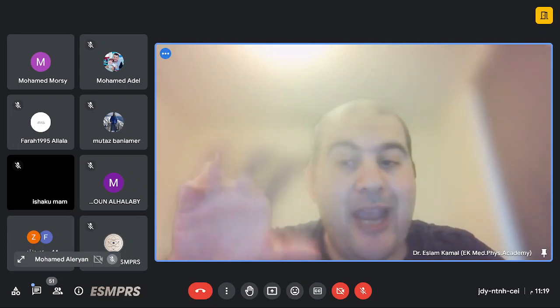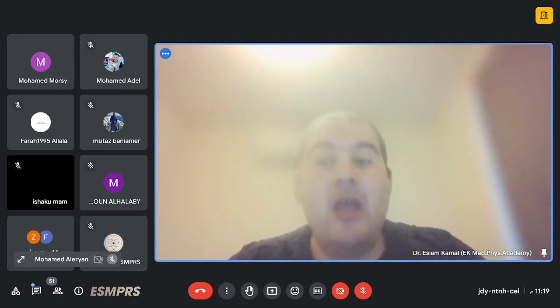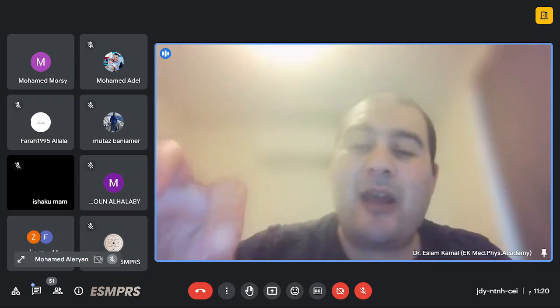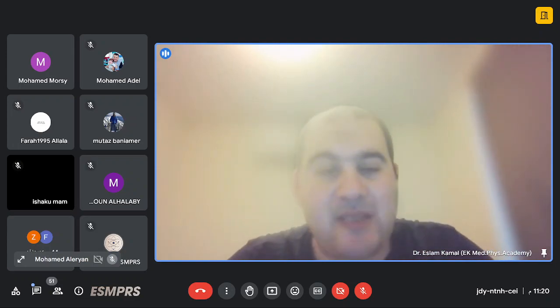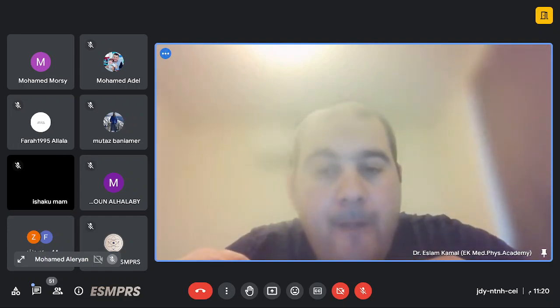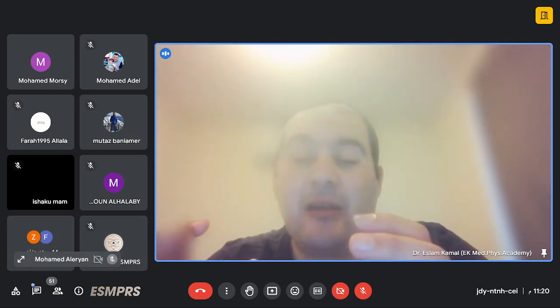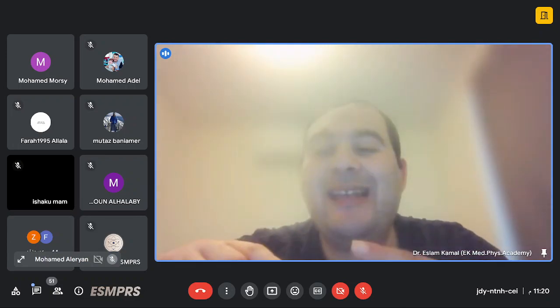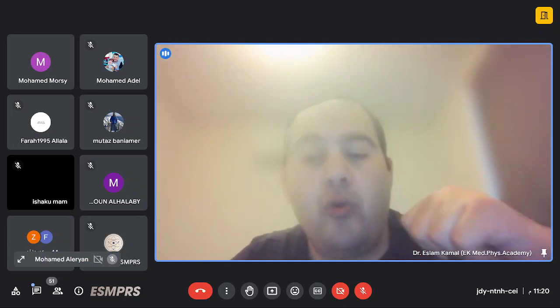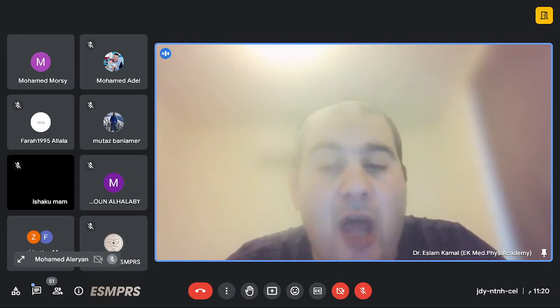فلو عندك تيشو، التيشو ده عايز تعرف هل موجود فيه فات ولا ووتر، الكونتنت بتاعه ده سيكونس يعرفك. او الفلويد اتنويتد انفرجن ريكفري، انك توصل الفلويد هو اللي يبقى عند النال بوينت، فلو في عندك ووتر كونتنت. طب الديفيوجن مثلا حضرتك ذكرته، انا هنا بلعب على الريستريكتيف ديفيوجن او حركه جزيئات الميه جوه الباثولوجي. فيقول لك لو انا عندي جلطه، هل الجلطه او عندي باثولوجي تخلي الحركه بتاعت جزيئات الميه متأيده ولا حره الحركه؟ فانت تعمل سيكونس تسميه الديفيوجن عشان يقيس حريه حركه جزيئات الميه. فلما تقول له ده الجزيئات بتاعت الميه دي اللي موجوده في الباثولوجي مش قادره تتحرك، يبقى في باثولوجي 100%. طب لا دي قادره تتحرك وبحريه، يبقى مفيش باثولوجي.